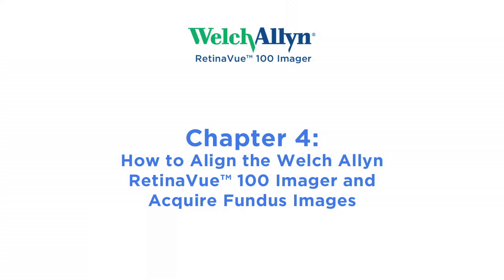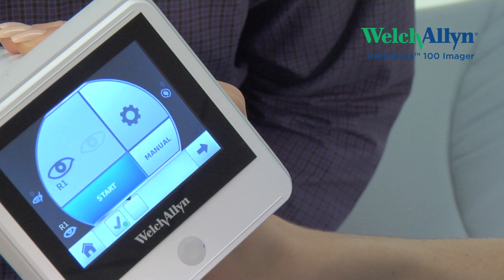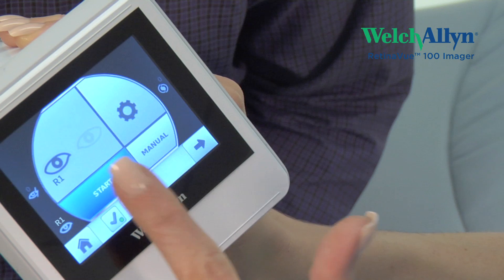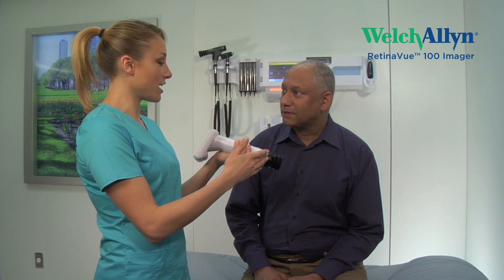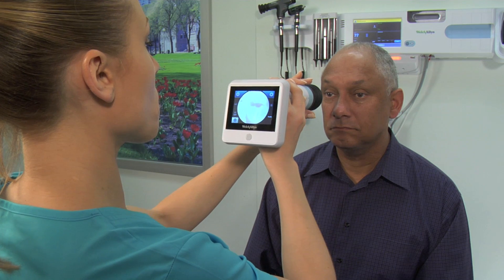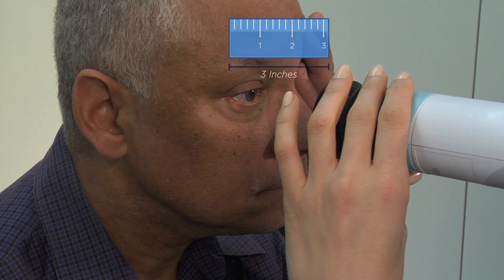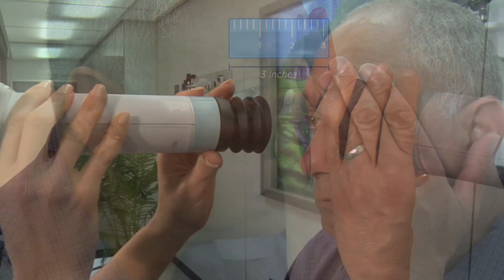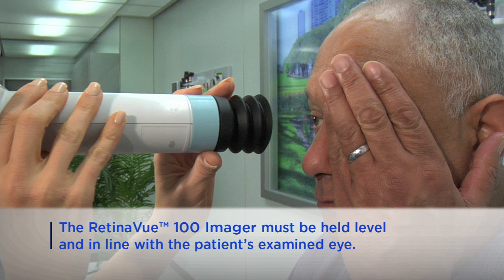Chapter 4: How to Align the Welch-Allen RetinaView Imager and Acquire Fundus Images. Touch Start to enter the image acquisition mode. Ask your patient to look at the green light inside the RV100 and to cover, but not close, their unexamined eye. Hold the RV100 imager so that it is the same height as the patient's eye, 2 to 3 inches directly in front of it. Be certain the RV100 is level and in line with the patient's eye.